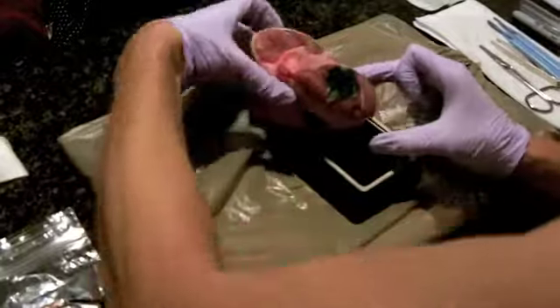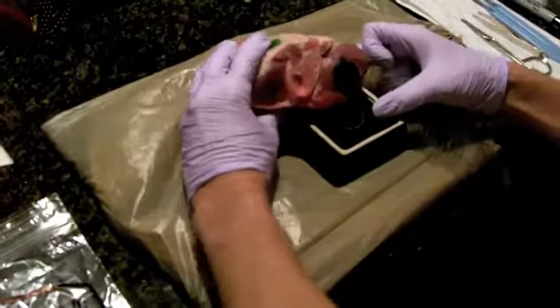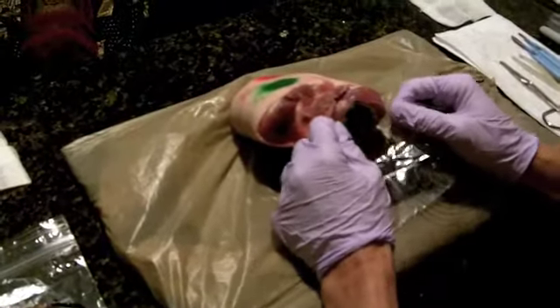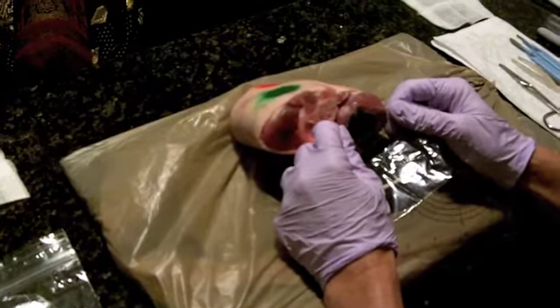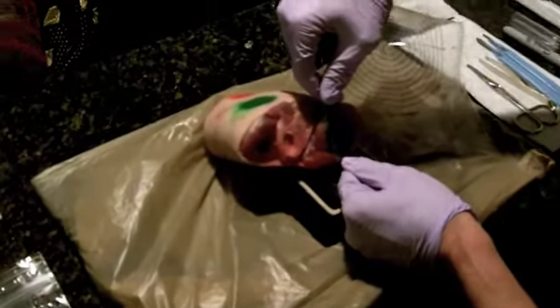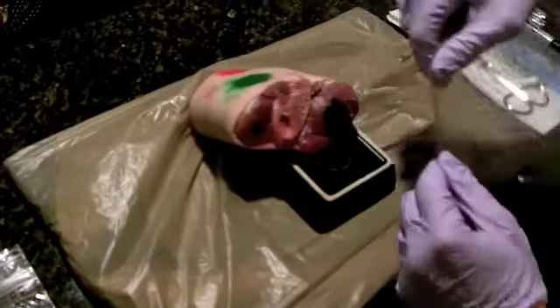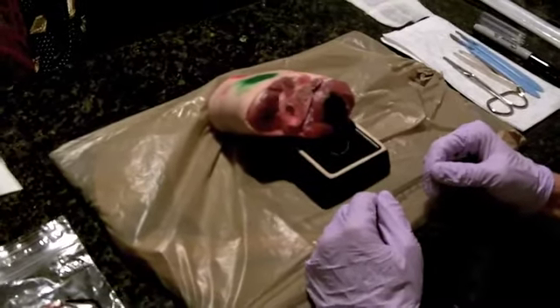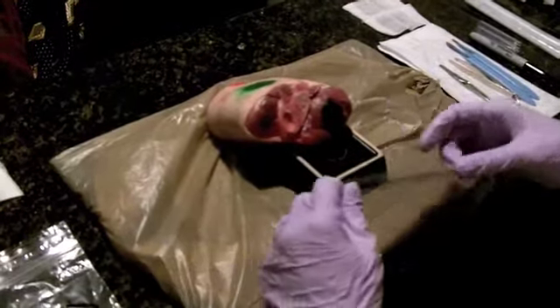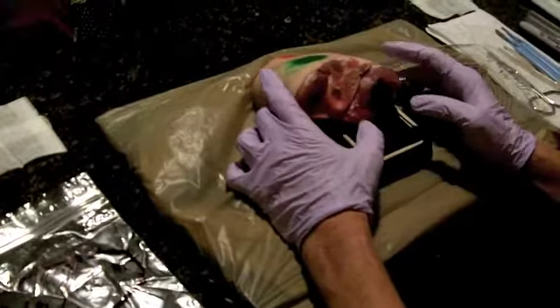And then we're going to compare it to the actual wound itself. Still with the 12 and 6 orientation. The widest portion — actually this is 12.5 instead of 12.7. And then the length is 12.5 as well. So there is a big discrepancy between the two. To be consistent, I think I would always measure the wound. So both of those are written down there, and for consistency sake, I will measure the surface area on the patient.